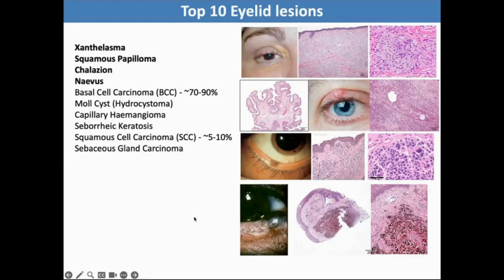There are special types of nevi which can also occur in the eyelid, such as this blue nevus, illustrated here clinically. It is very dense and has a dark black-bluish coloration, and is characterized by these heavily pigmented nevus cells, and can show a typical wedge-like arrangement.